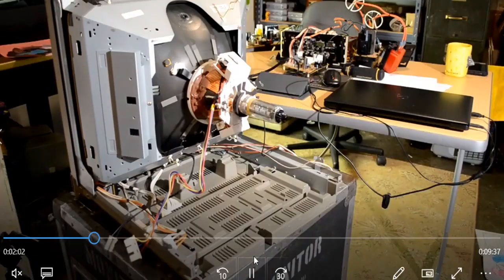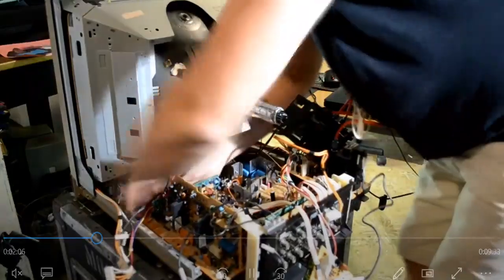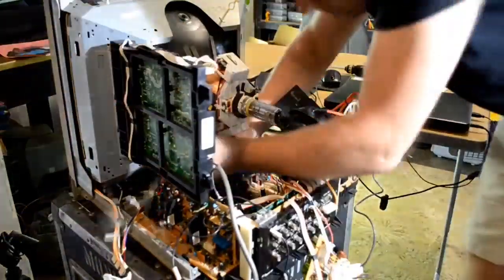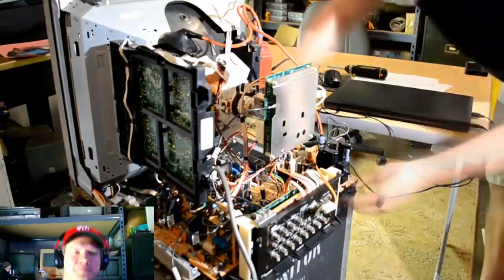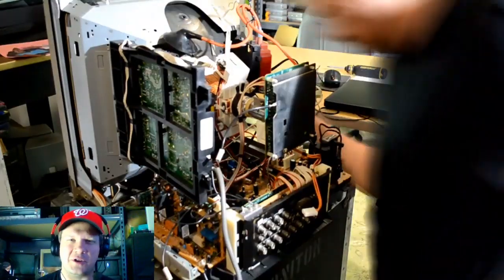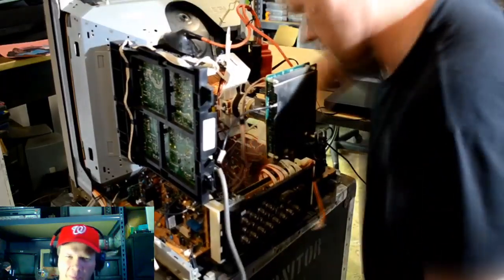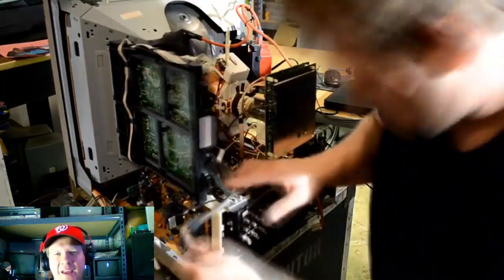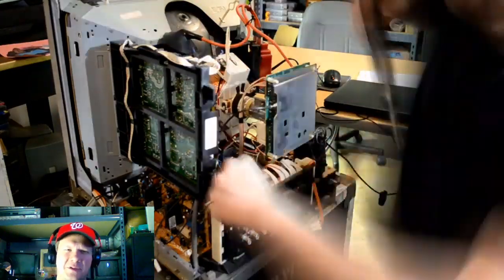Now, if you want to see a video about me recapping this monitor, I will tag it right here. It was a live show where I took the monitor apart, and then I actually went ahead and pulled all the boards. I showed you how I did that, because this one had a lot of different boards and a lot of little proprietary connectors in it. And so it's very important to make sure you do all that, take your time, especially with something like this.